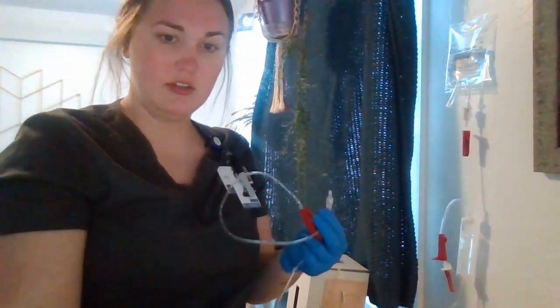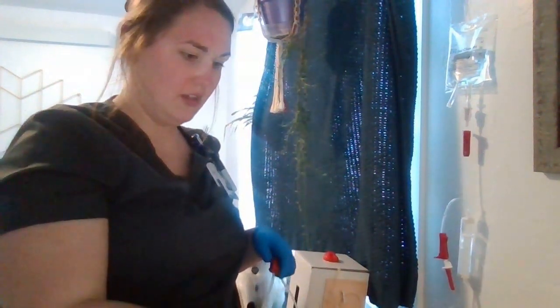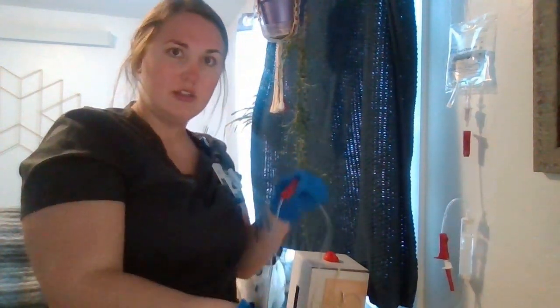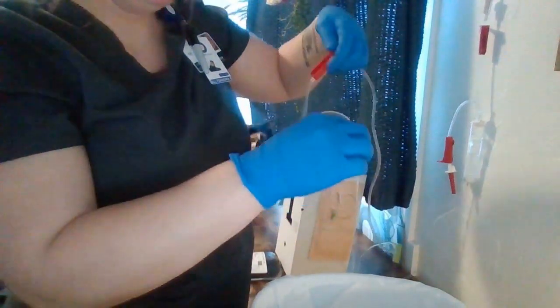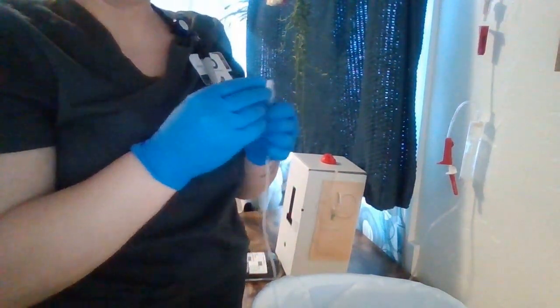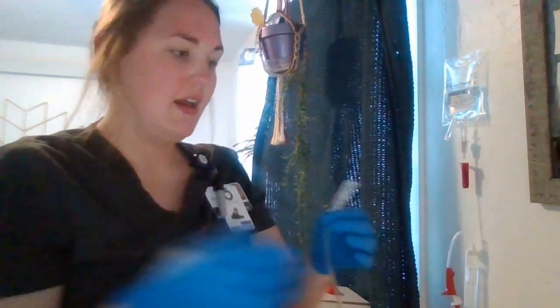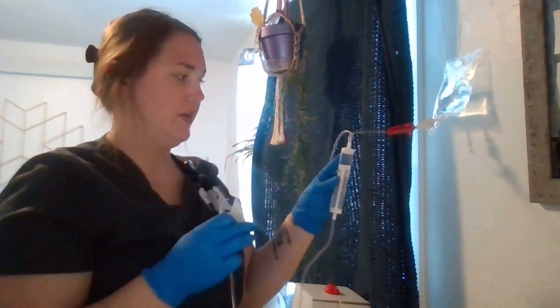I'm going to open this clamp to make sure that we get flow — you can see that flow. Once I've primed my tubing, I'm going to clamp this back up so that it's stopped and I'm going to put my cap back on, making sure that it stayed clean. I'm going to then hook it up to the patient's IV. Before that, I'm going to tap this filter and make sure all the air is out of there — no air bubbles.